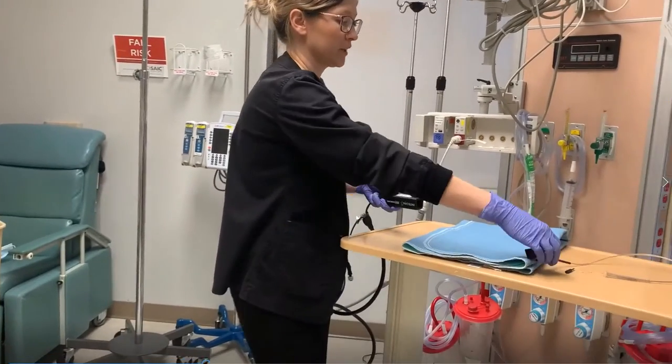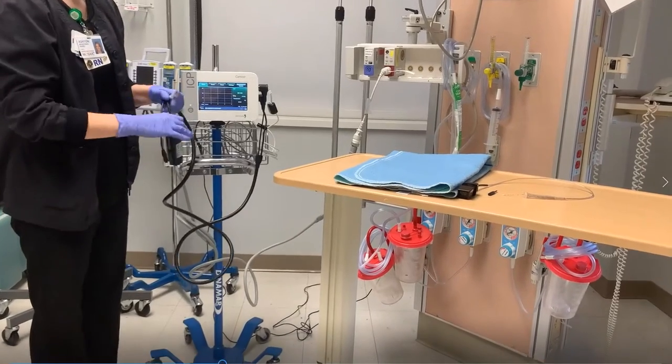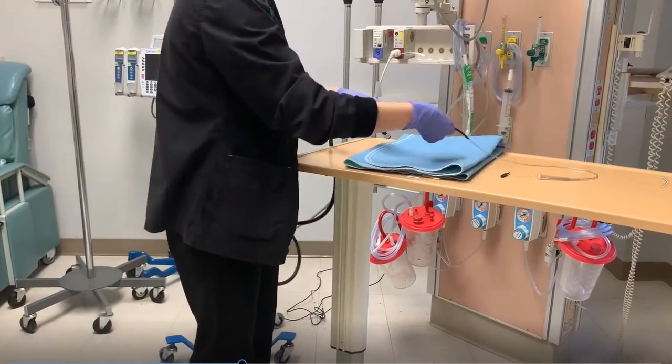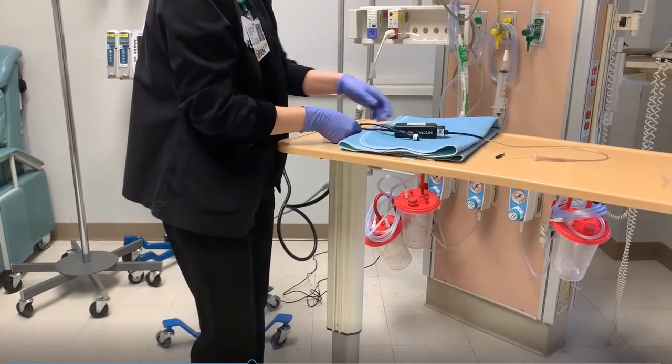They'll disconnect it and place the catheter, and you'll just wait. Once they get it inserted, they will reconnect this — it will be in the patient at this time.